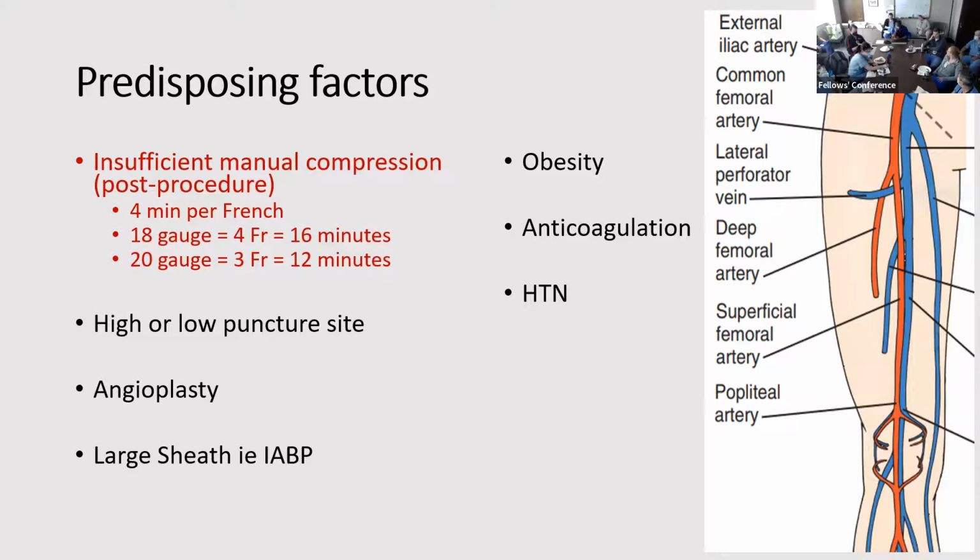We have something called a FemoStop. Have you guys seen those before? So if you can't hold pressure or something else is happening, you may want to query about a FemoStop. It's just a vascular occlusion device. You can put it right on that femoral site and pump it up, just like a blood pressure cuff, and it'll give you that requisite pressure.